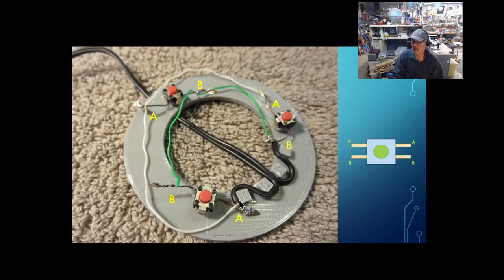And if you follow here, you can see what I'm calling A down here. A goes to the A of this switch. A goes to the A of this switch. And then do the same with B to B to B. And you're done with your soldering.